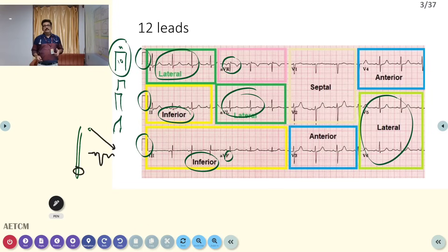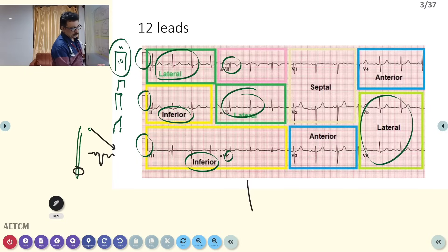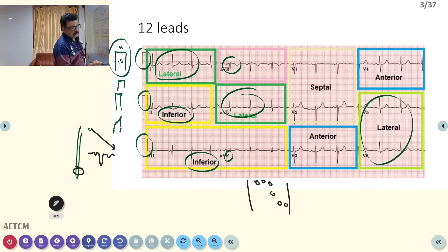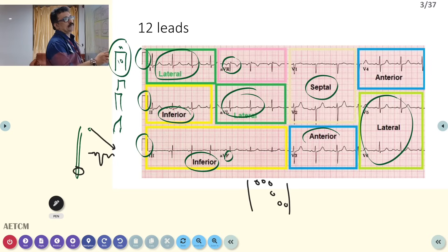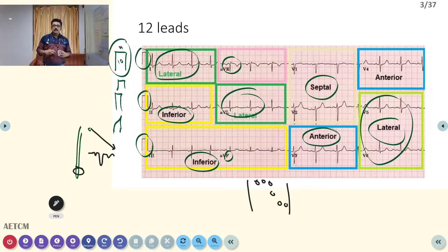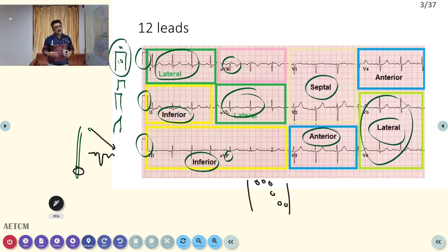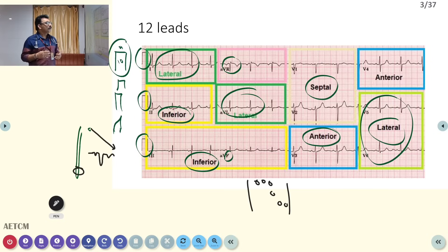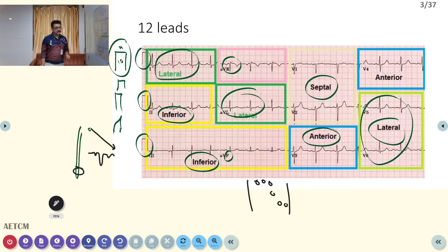V1 through V6 are on the anterior part of the chest. V1 and V2 are septal leads, V3 and V4 are anterior leads, and V5 and V6 are lateral leads. AVR is a right-sided lead. So if there is ST elevation in V1 and V2, you can diagnose anterior or septal myocardial infarction. ST elevation in leads 2, 3, and AVF indicates inferior wall myocardial infarction.